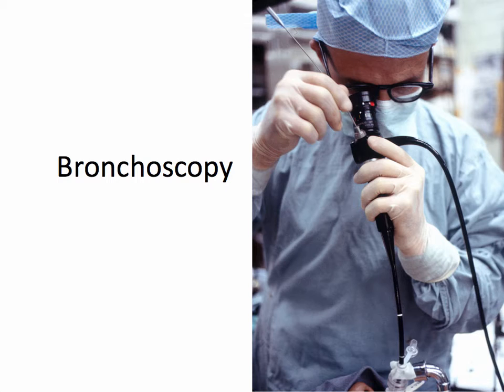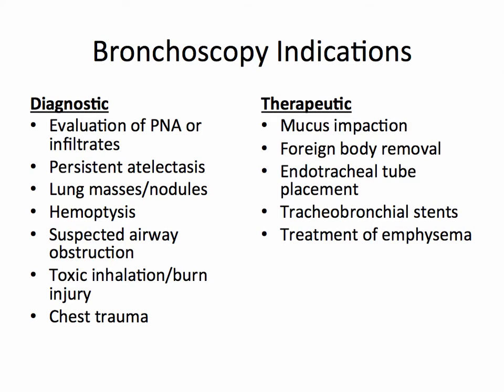Bronchoscopy is an endoscopic procedure that visualizes the tracheobronchial tree by placing a bronchoscope into the airway. There are two different groups of indications for bronchoscopy: diagnostic and therapeutic.